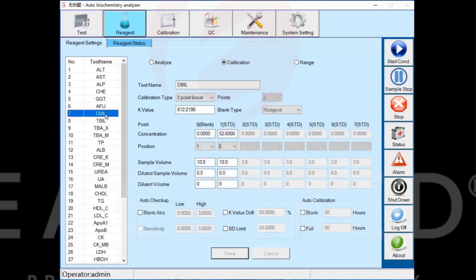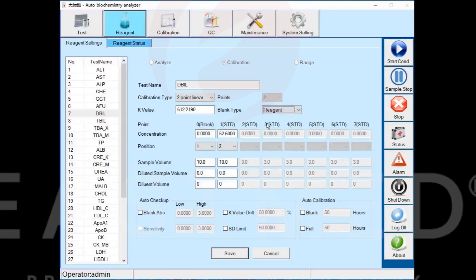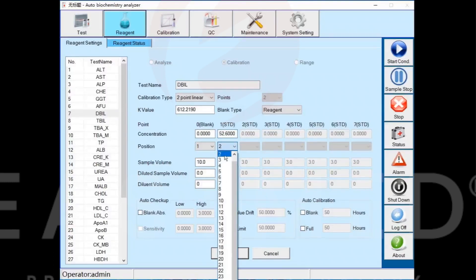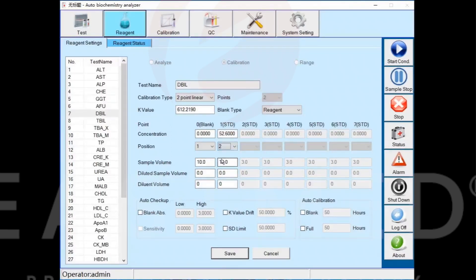Under two-point linear calibration method items, select reagent blank. Enter concentration zero and select the designated position for water. Enter the calibration solution concentration, select a designated position for calibration solution. Make sure that the calibration sample volume matches the analyze interface sample volume. Click the save button to save.